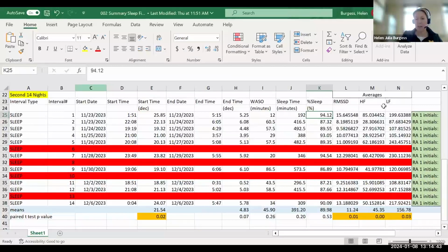And just mentioning that you can extract these heart rate variability metrics from the Fitbit. I think this varies according to which Fitbit you use, but for Charge 5, and I think 6 as well, you can do this. You get time domain measures, the root mean squared successive difference, but you can also get the frequency domain measures. And these are exported in 5-minute epochs. And I believe that's because you need at least 5 minutes of data to calculate a lot of these metrics in terms of just having a stable signal.